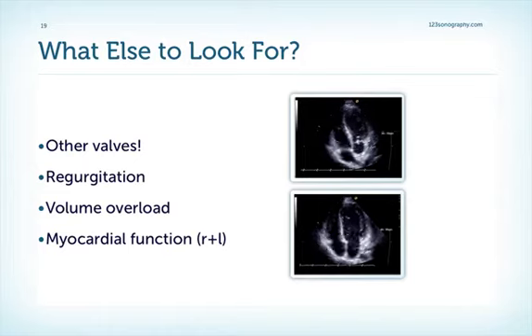And finally, look at left and right ventricular function, because patients who are in sepsis often show deterioration of right ventricular function. Here's a nice example of a patient who has endocarditis. Probably not fresh endocarditis anymore, but even without using color Doppler, you can appreciate that the patient must have significant aortic regurgitation. The left ventricle is dilated and hyperdynamic.